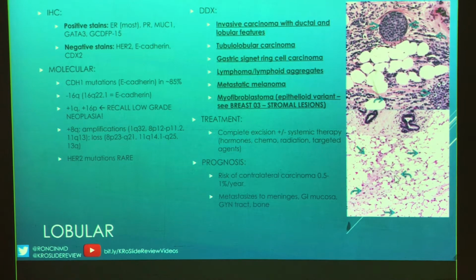And over here, you can see how these are really, really sneaky. These are your cancer cells that are within the fibroadipose, and they've almost disappeared to nothing. So chances are this was a treated case. But just like when we talked about bone soft tissue, and we were talking about, is this a well-differentiated liposarcoma? Is this an atypical lipomatous tumor, right? Remember those, we have those two together. You also want to consider, is this an invasive lobular? So always look at the fat, be skeptical.